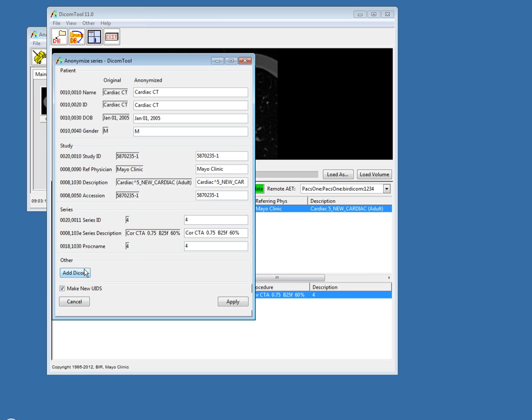Further, you can add additional DICOM tags. If there are fields not listed that you want to anonymize, you can add those DICOM tags and anonymize those. For instance, if you wanted to remove the study date, you would just add the DICOM field for study date and then that could be changed. This is very useful if you're doing blinded studies and need to remove this information.